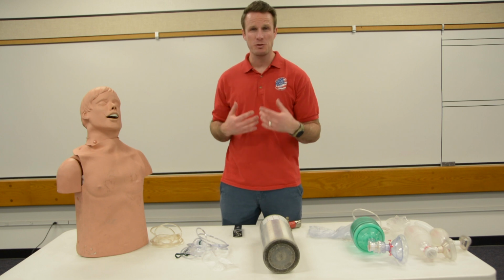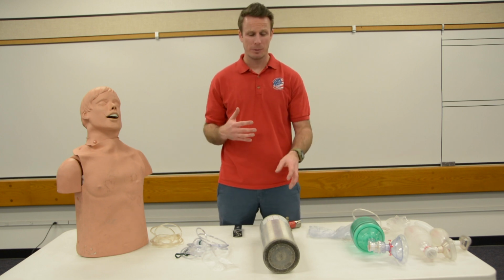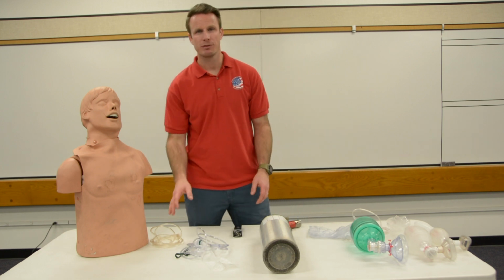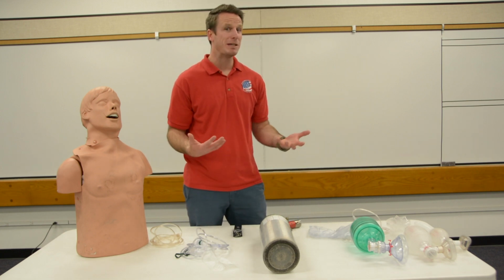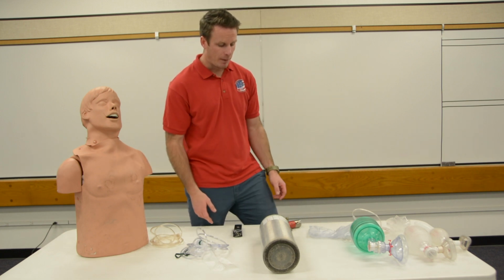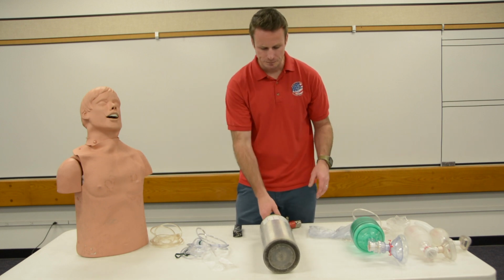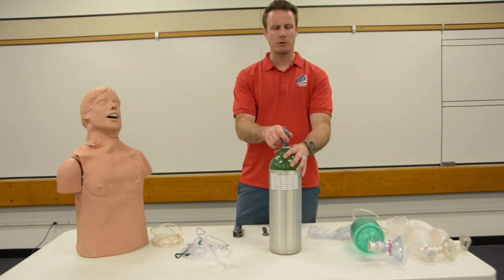My name is Tyler Andrews, and today we're going to be going over how to properly set up an oxygen tank and then how to administer oxygen through a couple different devices that we have to administer oxygen to a patient. First thing we want to do is set up our oxygen tank, make sure it's ready to go. So I got an oxygen tank right here.